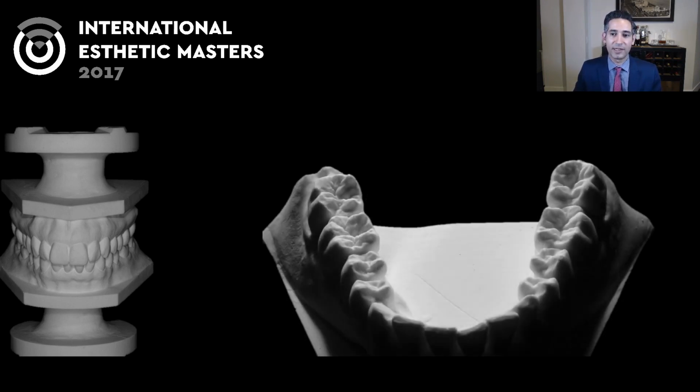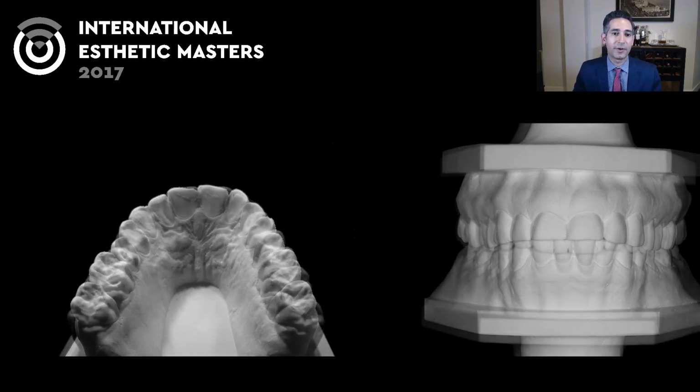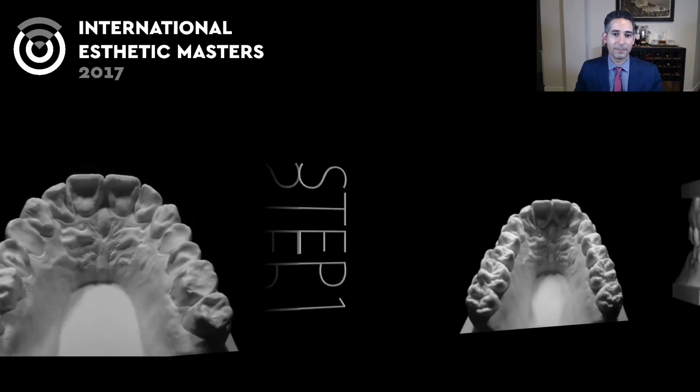So here we have the final wax up of the upper and lowers, and we got full anatomy and everything. It's primarily, or actually entirely, additive because we're trying to restore what's been lost due to erosion. So if you look at this, you'll see how it is before, and then how it morphs into the final situation with the increased vertical and all the anatomy restored.